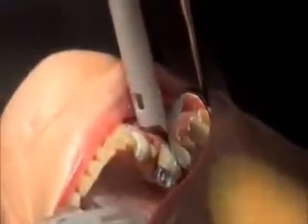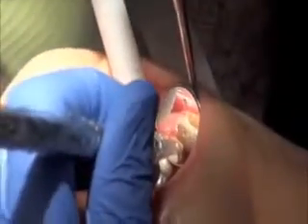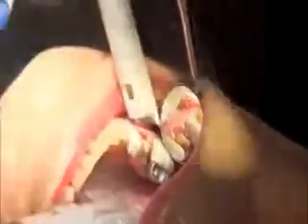The laser is then used to delineate the margins — the edge where the crown will meet the natural tooth structure. This ensures a perfect seal which is accurate to five hundredths of a millimeter, or 50 microns.